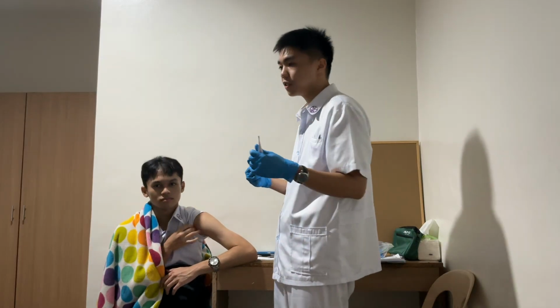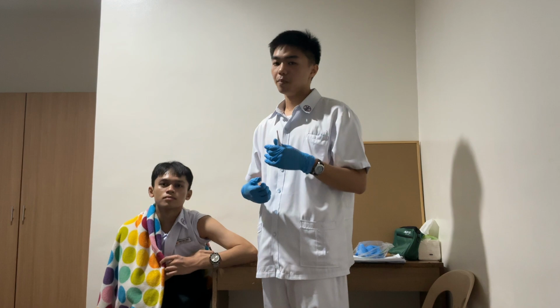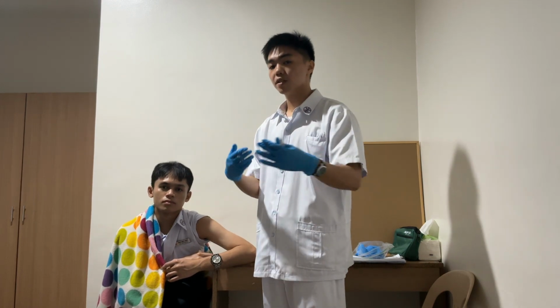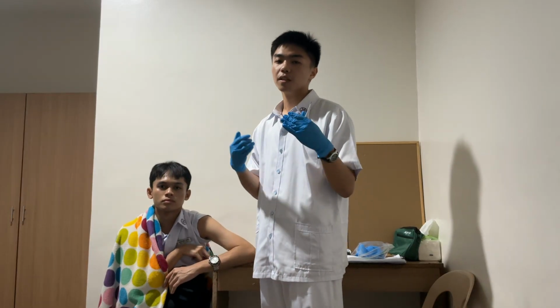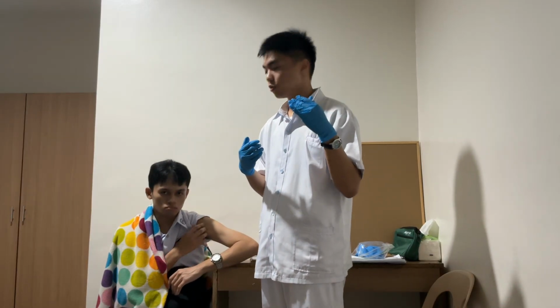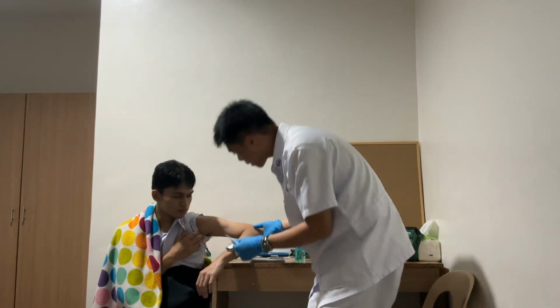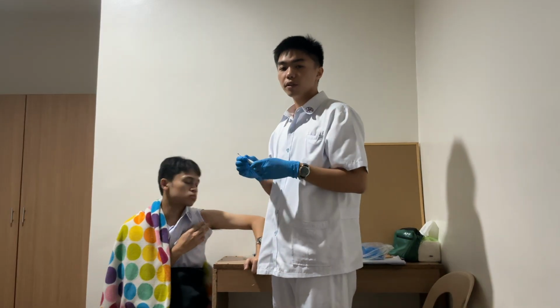If there are lesions, of course, it might cause discomfort or pain to the patient. And for perspiration, we have to wipe this if there is any so that we will yield accurate results, because if there's moisture, it may alter the temperature to get it too cold. Assuming now that there is no perspiration and it is safe to use, I'm going to turn on the thermometer.